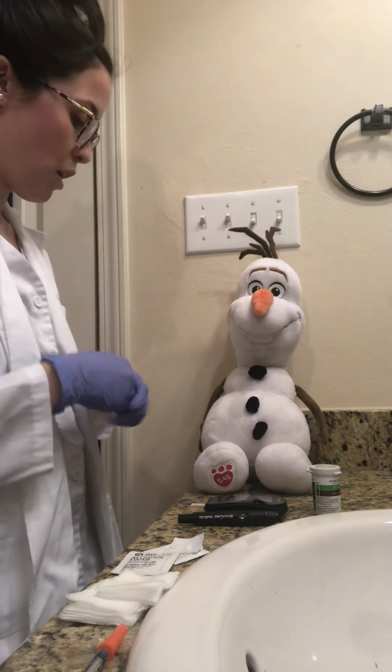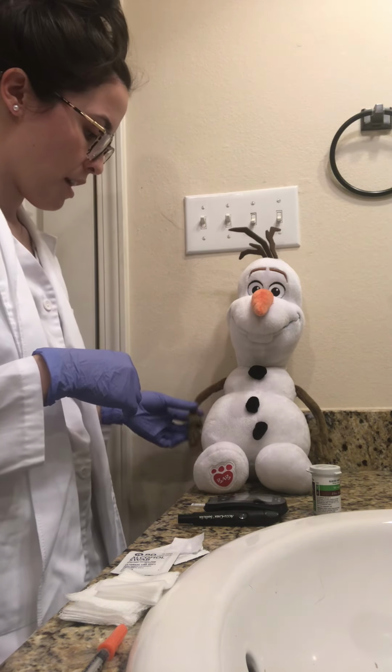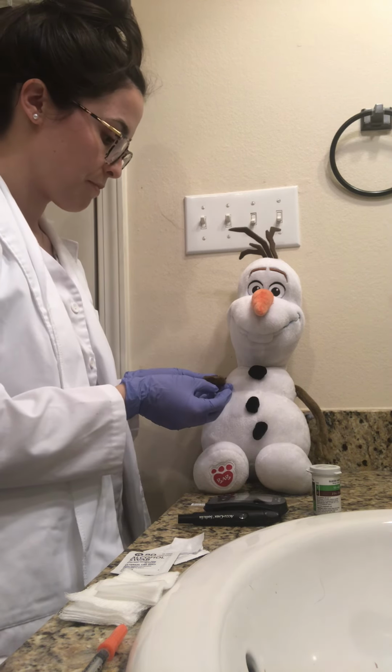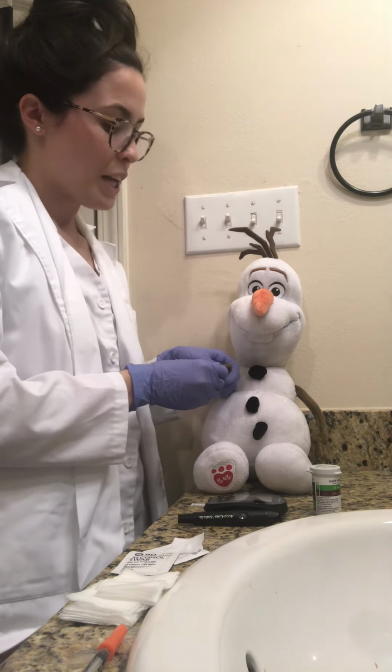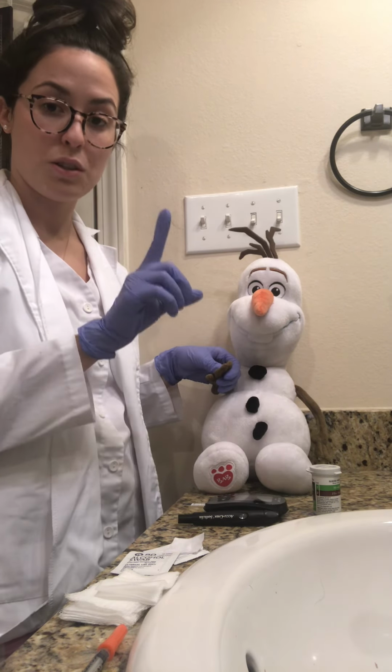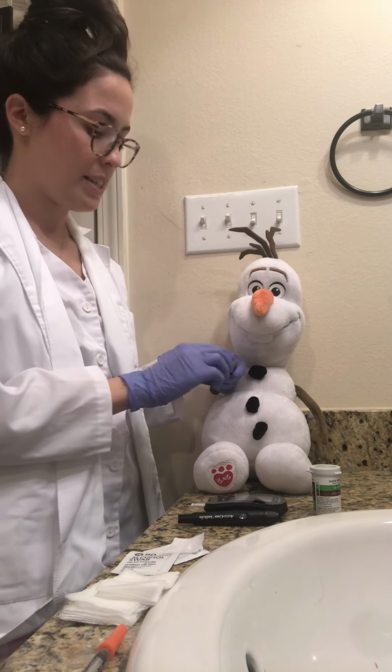So, Mr. Olaf, your hands are now all clean. I'm just going to look at your fingers. Do you have a preference on which finger you'd like me to stick? Okay, great. When we go to stick the finger, we want to be sure to use the lateral distal pad of the finger to get the blood.